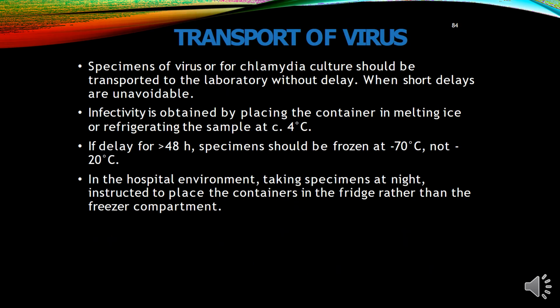Transport is done by using cold chain at 4 degrees Celsius. If delay of more than 48 hours is expected, use -70 degrees, not -20. Understood? In case of hospital environment, take the specimen at night and store it in the fridge rather than the freezer.